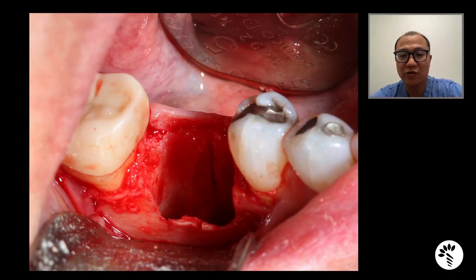Extraction was done in a very atraumatic manner. We sectioned the mesial and distal root. This is how the socket looked like. You can clearly see, as we anticipated, there was crestal buccal dehiscence of about 3–4 mm. You can clearly see the level of the crestal bone at the mid-buccal aspect is much lower than the proximal aspect.